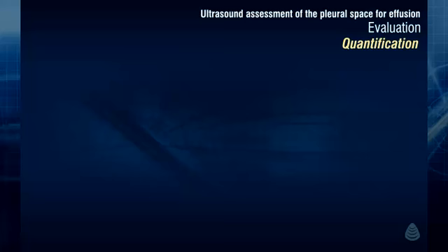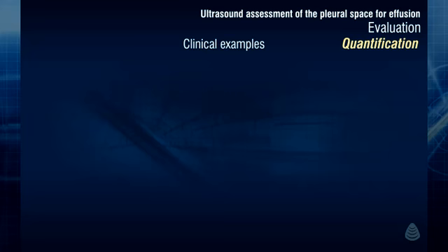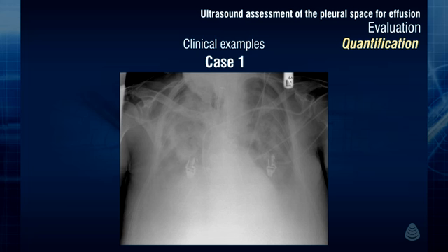Let's now apply these methods using clinical examples. Case 1. The chest X-ray of this patient is first shown. Both lungs look fairly wet, and an ultrasound study will help to assess and semi-quantify the amount of pleural fluid.